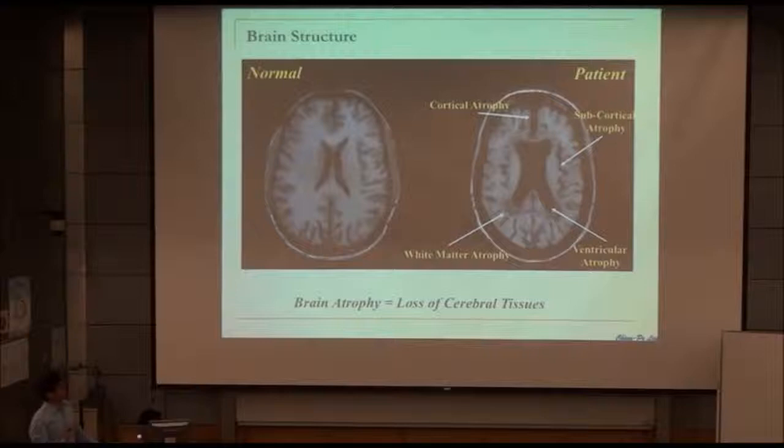But for us, when we consider structural information or what changes follow aging or the progression of dementia, such techniques can also provide some information. For example, this is a young population, and we can see the structure compared to patients with schizophrenia or dementia, or even some aging populations.